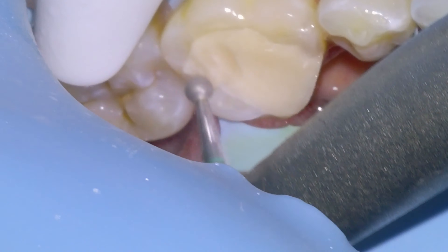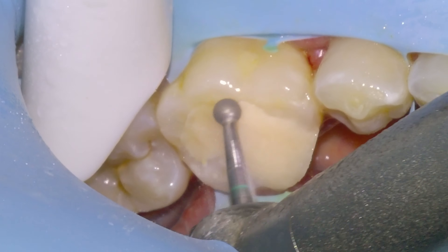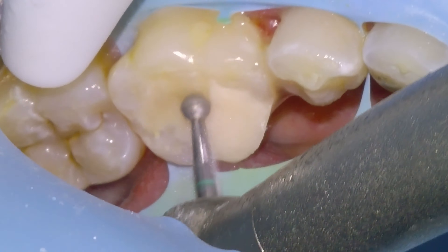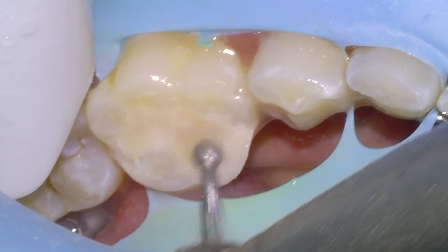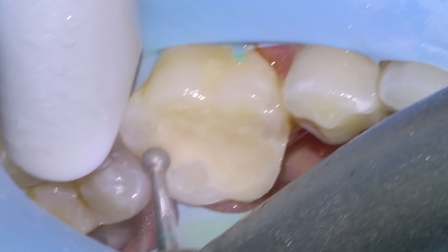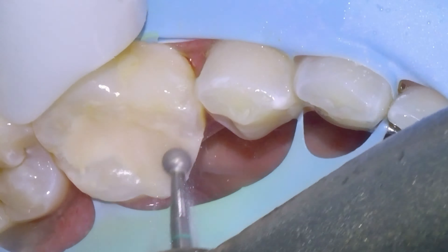A few moments later — I'll typically wait about four minutes for the material to set before going back and removing the excess. Here we are with a large round diamond, taking away the excess filling material until we're back on the natural margins. Once we've done the gross reduction with the diamond, we're going to go in with a carbide bur in just a moment.